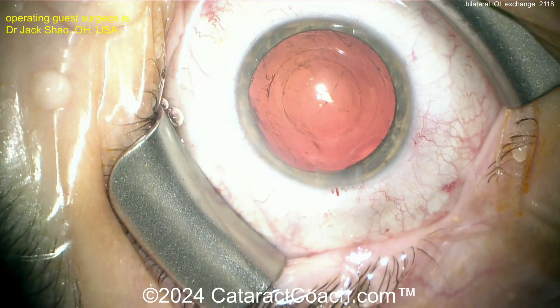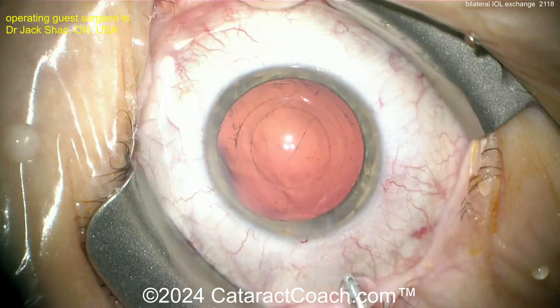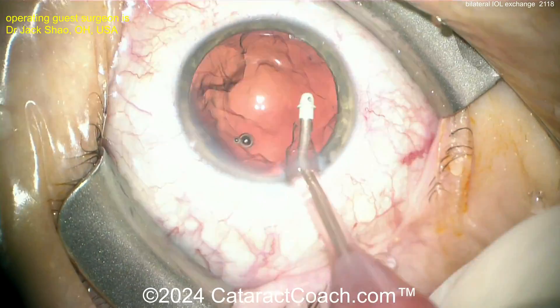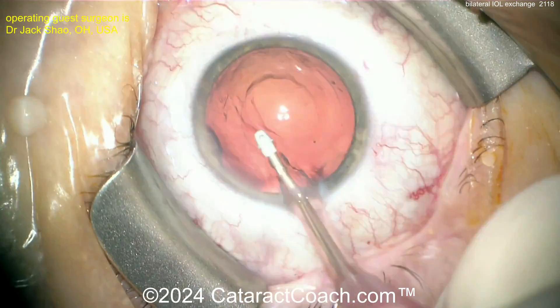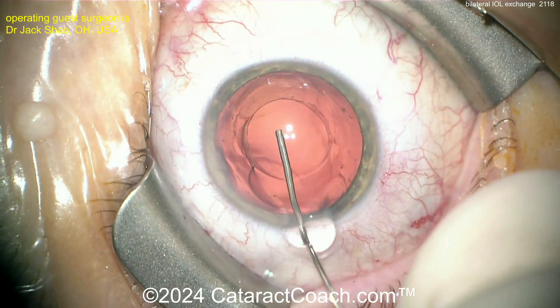Forget the twist — just yank it out. Hey, it works great, no problem. Now the new lens goes in. It's interesting that this patient did not want the benefits of multifocality. We've got to explain to patients that there's always a trade-off: if you get a multifocal or trifocal lens, you're going to give up some degree of image quality to achieve that convenience of a wider range.